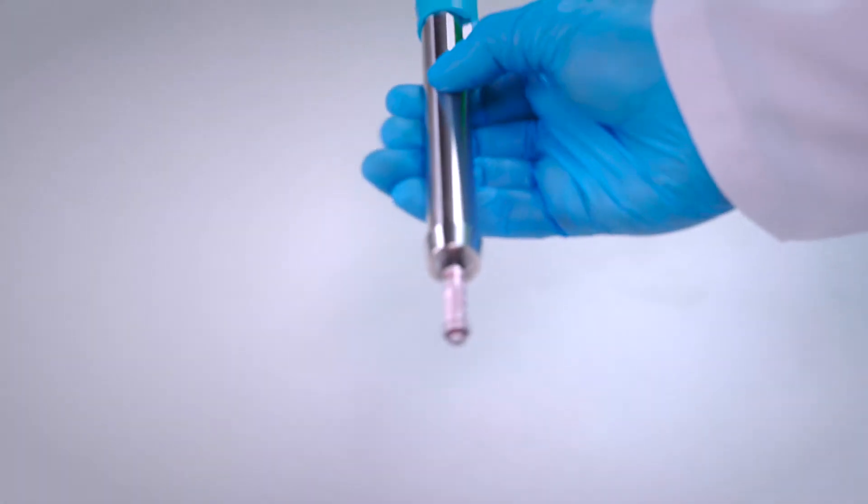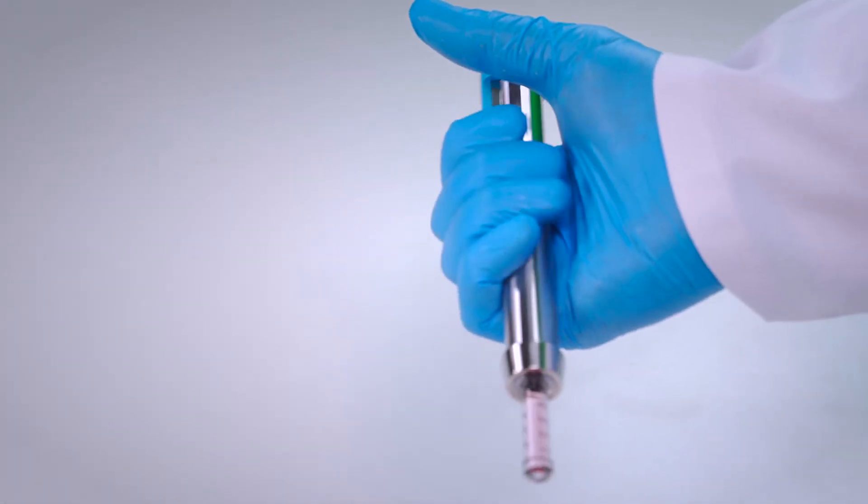Hold the NFIS device firmly between your palm and fingers in a thumbs up position.